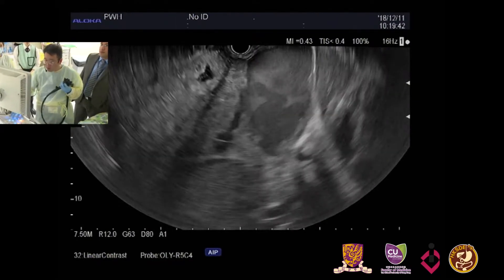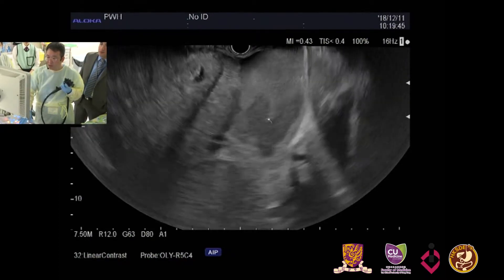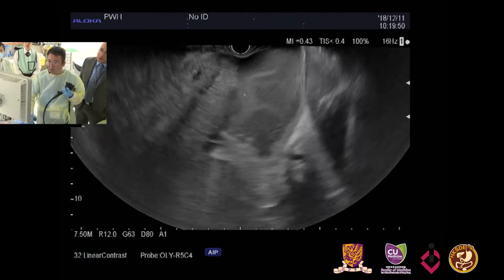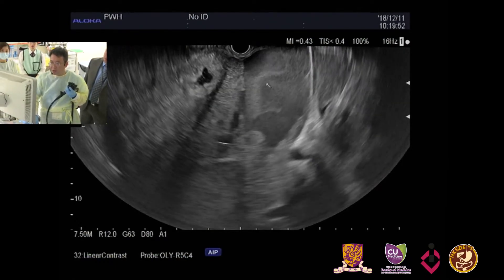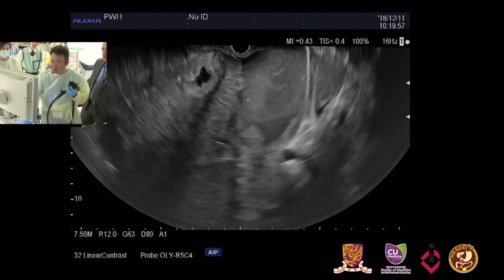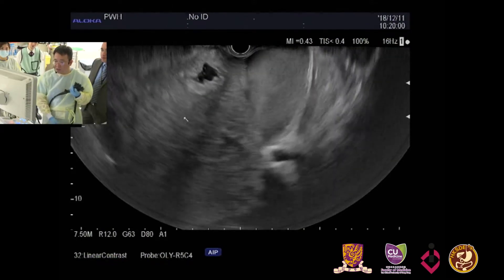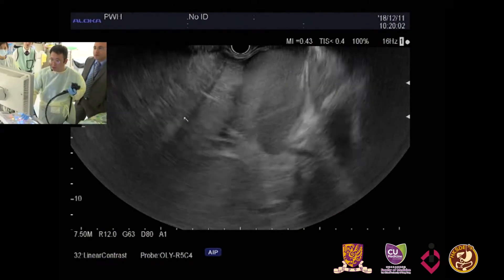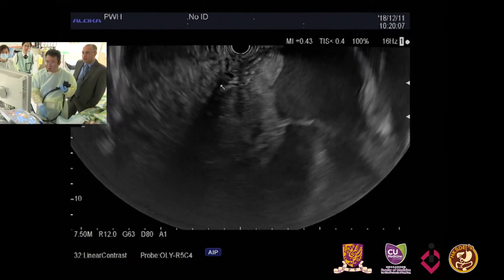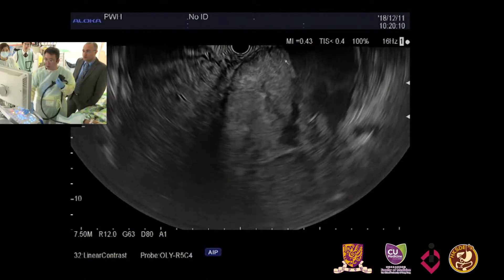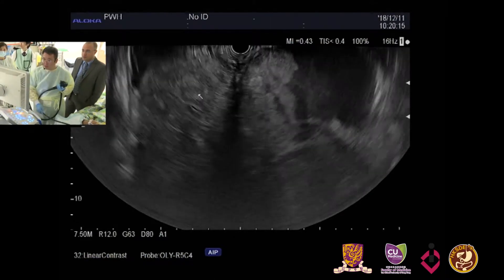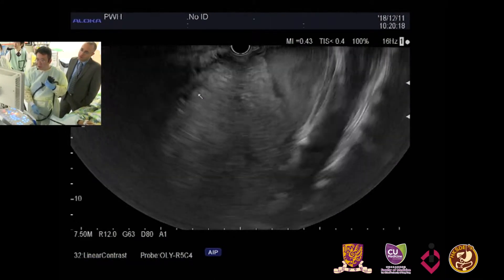You can see there are several different compartments. Here is a cystic region — you can see a lot of floating echogenic debris. In echotexture, this may represent blood. Another part is solid with some necrotic areas, and another part is also solid. Maybe some is viable tissue and some is necrotic tissue. The key question is: what is the origin?